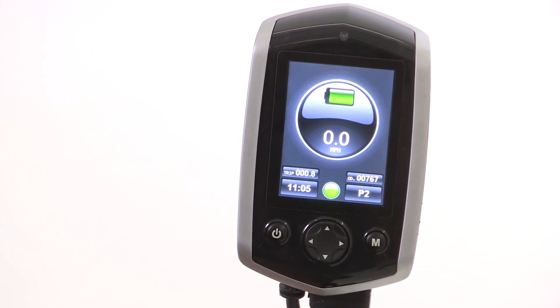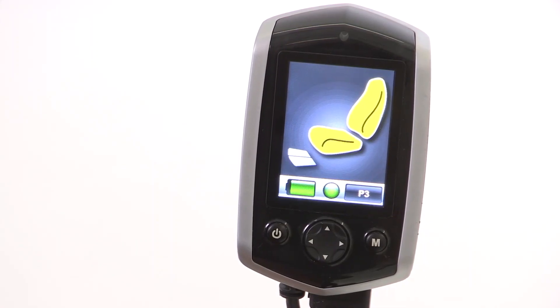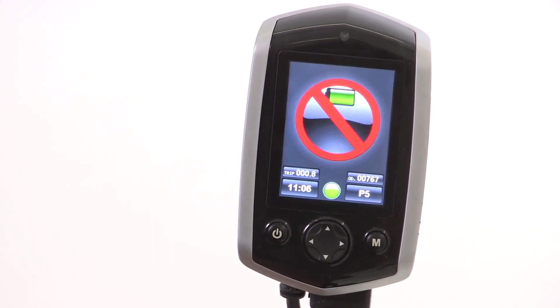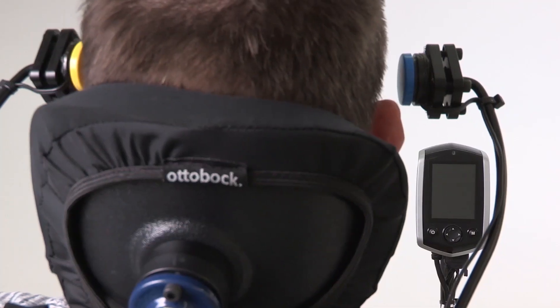In the current video the user has a Quantum R4000 powered wheelchair with Q-Logic 2 electronics. Several wheelchair parameters have been adjusted using the wheelchair programming software for smooth functioning of the head array system. The assembly consists of two head switches attached to an Otto Bock headrest using stealth swing away brackets.